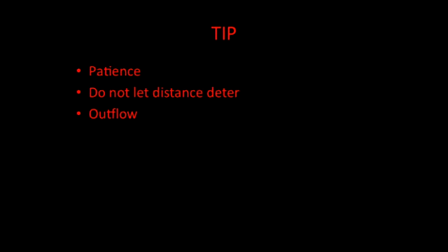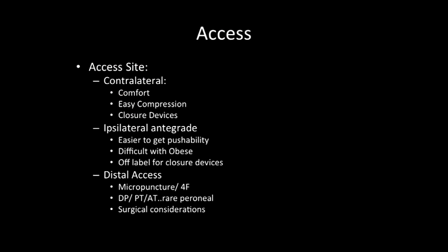It's primarily from below, from the popliteal. Why? Because from the top, we can't possibly get access when we don't have any stump. It's flush. We will not know where to go unless from below. And now this was planned for what we call a subintimal angioplasty. You can see here, note this carefully. You can see the wire curve, and we go up and re-enter.